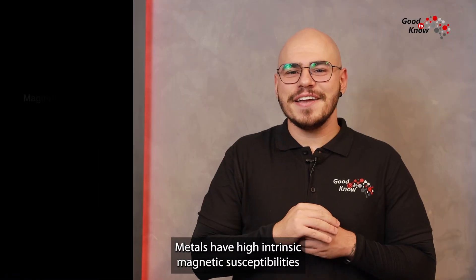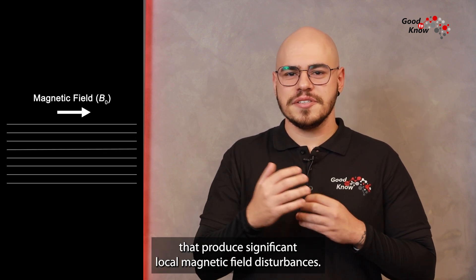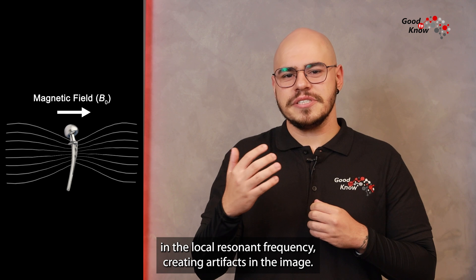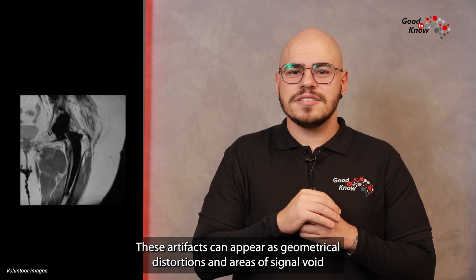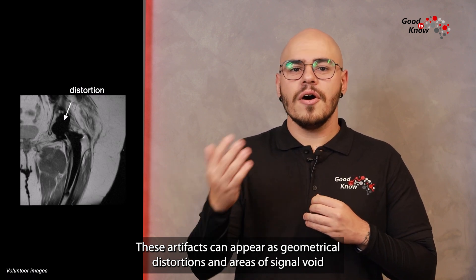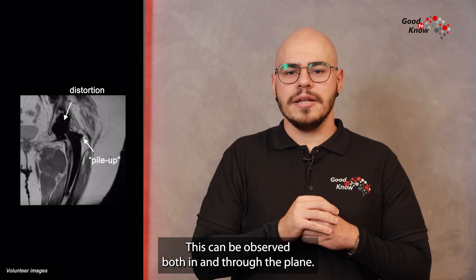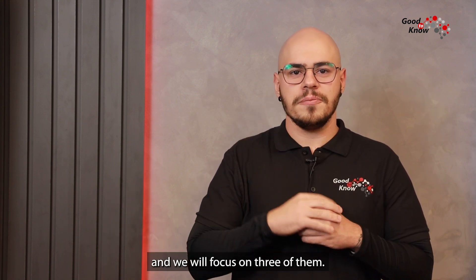Metals have high intrinsic magnetic susceptibilities that produce significant local magnetic field disturbances. These magnetic field distortions result in unintended variations in the local resonant frequency, creating artifacts in the image. These artifacts can appear as geometrical distortions and areas of signal void or signal concentration, often called signal pileup. These can be observed both in and through the plate. There are many different approaches to reduce metal artifacts and we will focus on three of them.